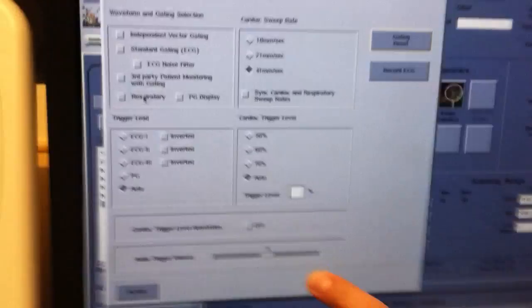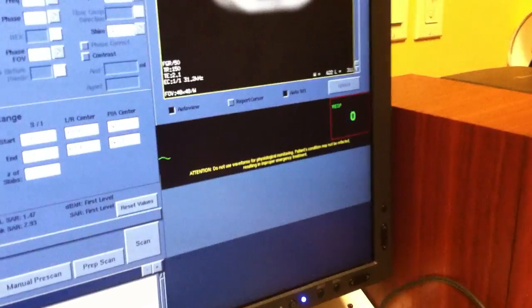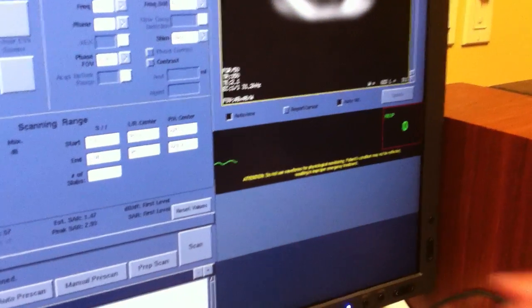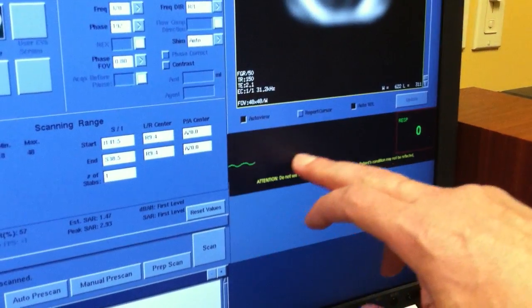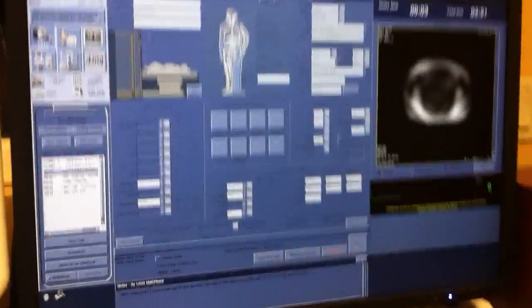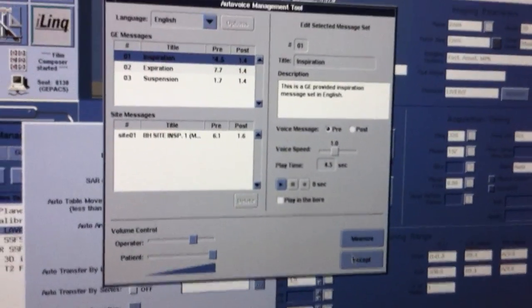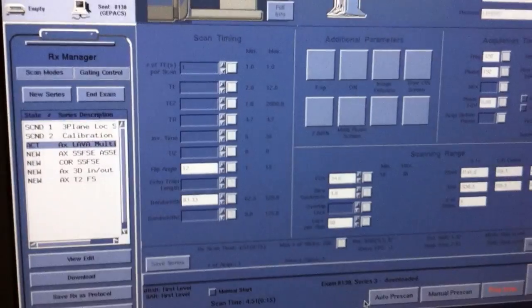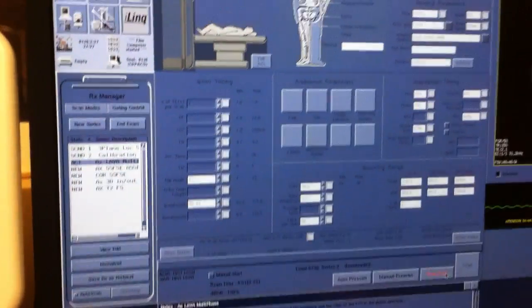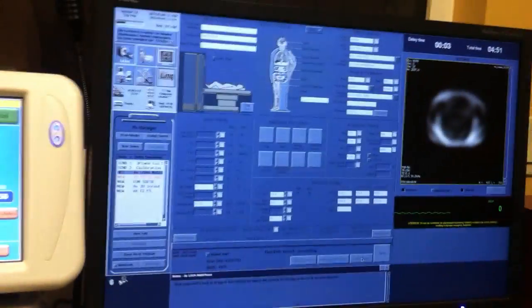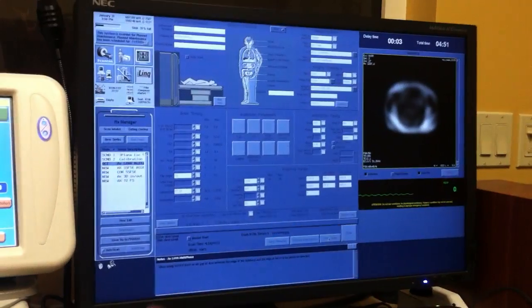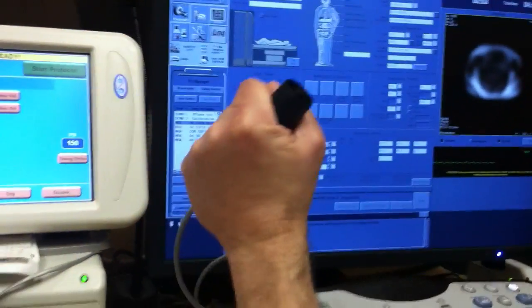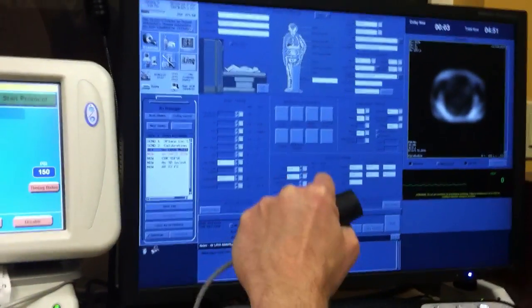Another thing is you want to turn on your gating control, your respiratory control. Some of your sequences, you might have to respiratory gate because the patient can't hold their breath well. And this is going to show the waveform if they're holding their breath or not. We save, download, and we'll scan this. Now, pay close attention. Let me turn up the auto voice so you can hear it. And it's saying to prep scan it. You don't want to go straight to scan because we need to time our contrast injection with the scanner.